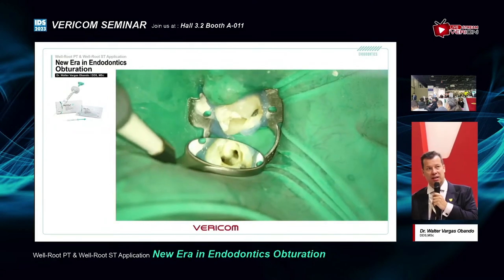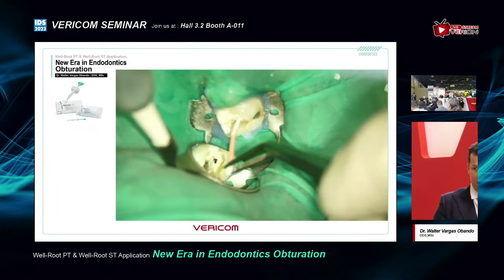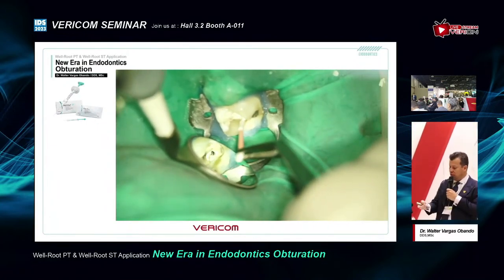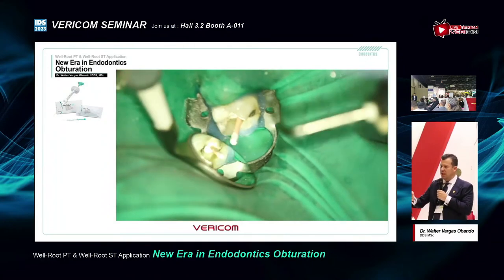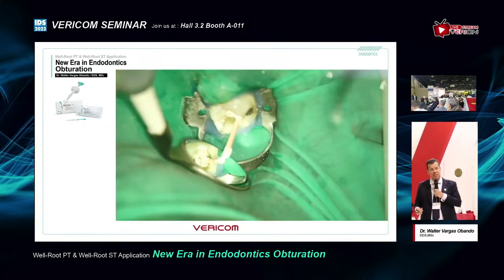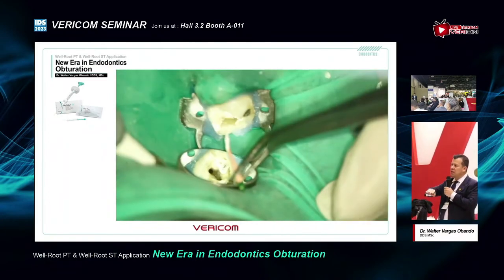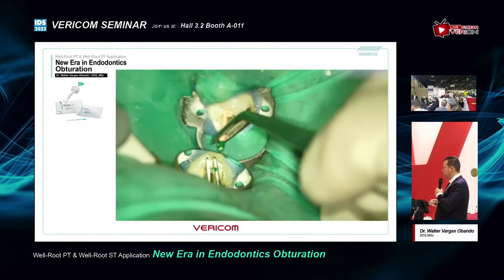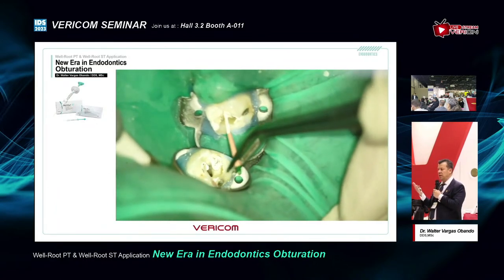I will show you in a clinical case what I do. I really like to dispense the bioceramic sealer on my glass slab, and then I use the cone to take more cement inside, going out, do it again, and then going inside, and then I coat with my heat carrier. This is the way that I do it. You don't need to push the heat carrier inside the canal. You only need to coat on the floor of the chamber, and that's it. Because the bioceramic sealer is very sensitive to heating, you need to be careful not to overheat it.